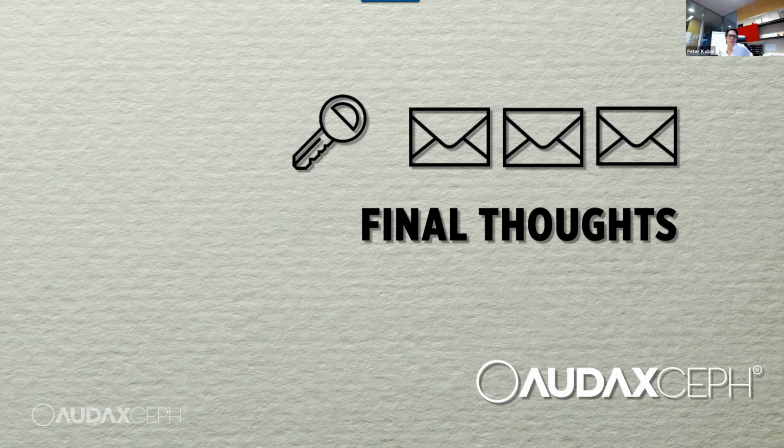Okay, I just want to go over some final thoughts about the advantages of making the decision to upgrade your current software version to AudaxCeph version 6.